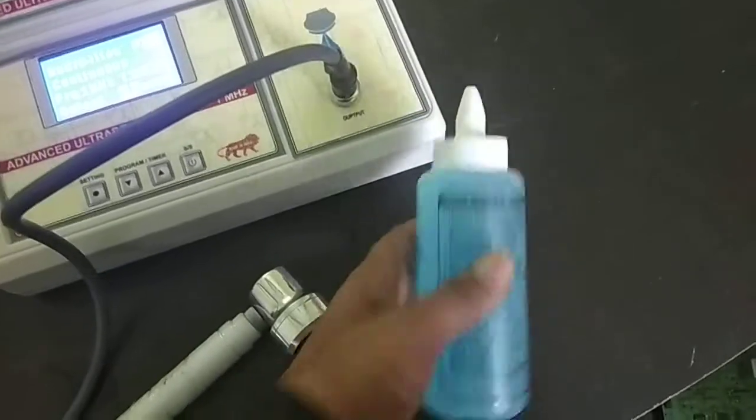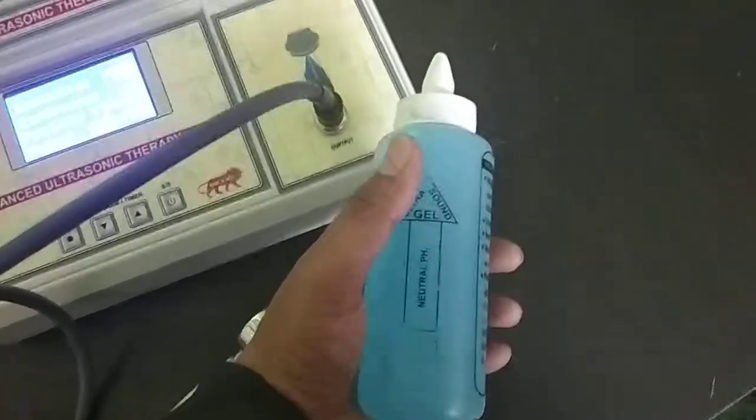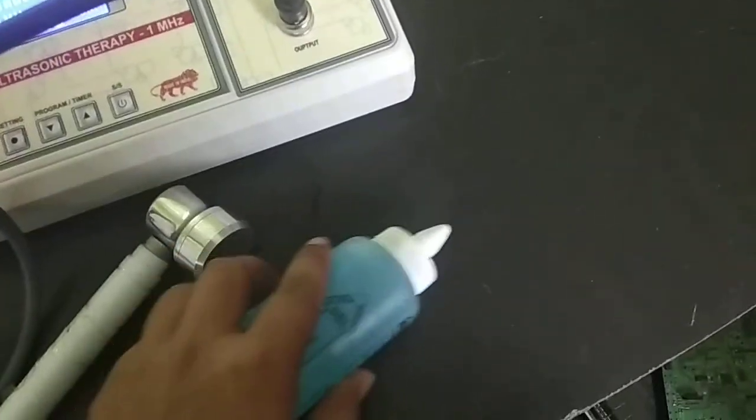This is a gel bottle. You have to apply the gel on the treatment area.